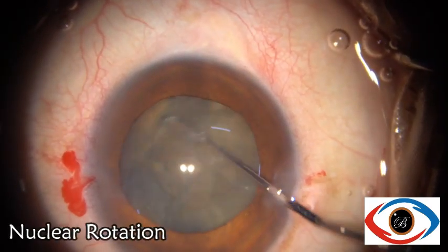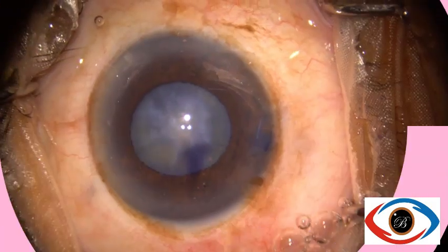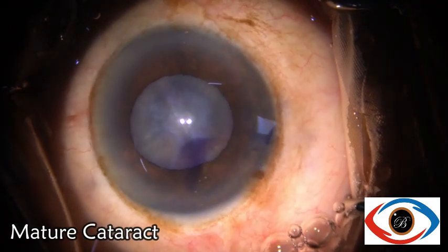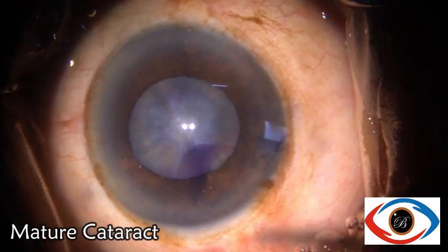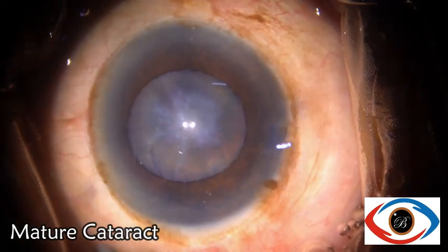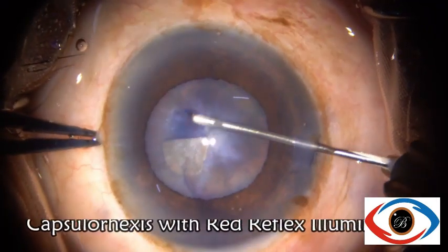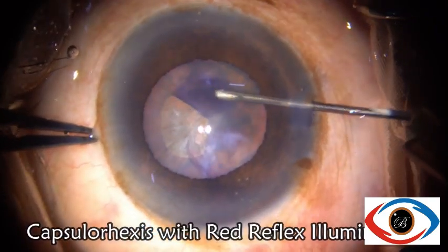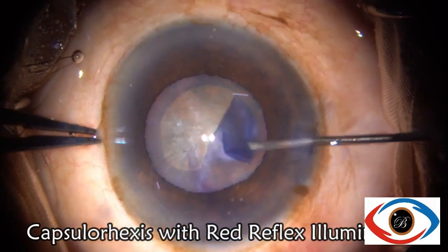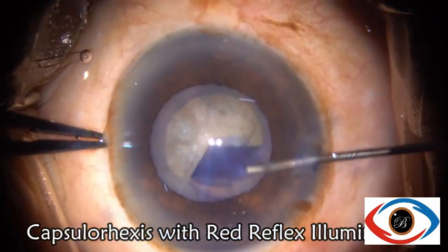The second case is that of a mature cataract. Even after staining the entire capsule with trypan blue, red reflex illumination provides better contrast for performing the rhexis. We can see the capsular edge much more easily as there is good contrast provided by the red reflex.